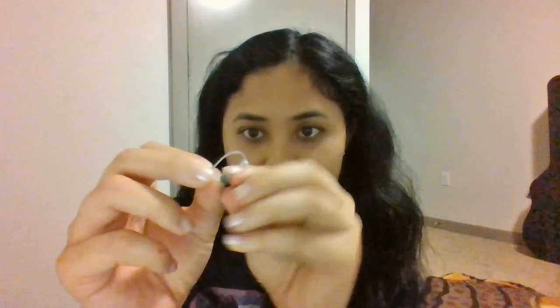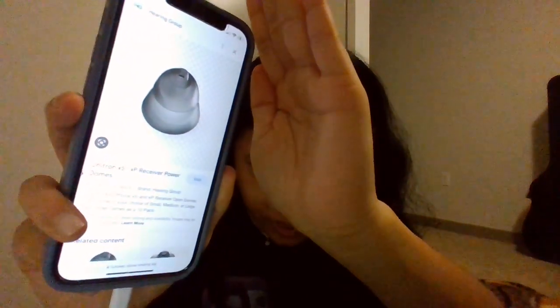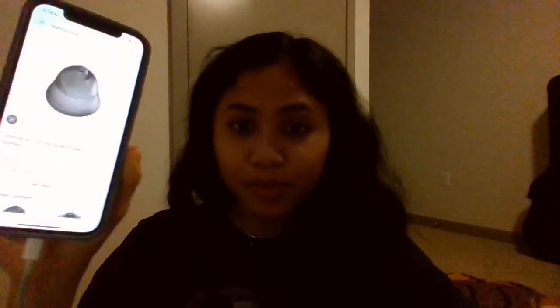For you, we would use a power dome. It's not like this one — this one has a lot of holes inside. The power domes look a little more closed and a little more rounded, because you really want to trap in those sounds. We'll give you some domes.